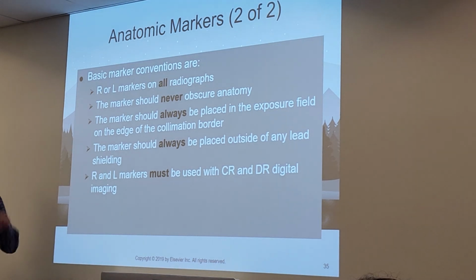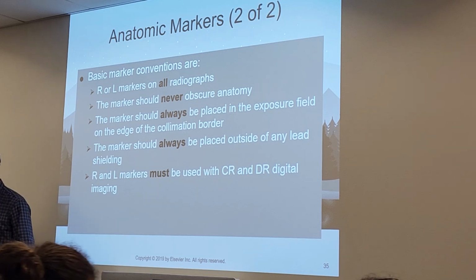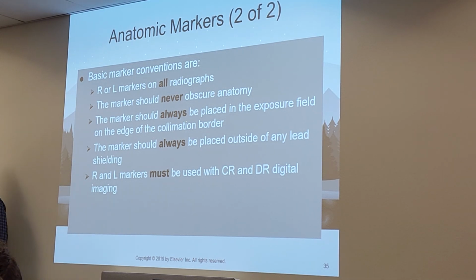And as students, after your initials, you will have a small s to indicate that you're a student. That way, we can identify who took that image. So if we ever need to go back, we can talk to that person. If there was an issue with the patient, we can go back to the tech and ask, do you remember this patient that you did? These are the images that you shot. So it's a way to identify which tech did which image.